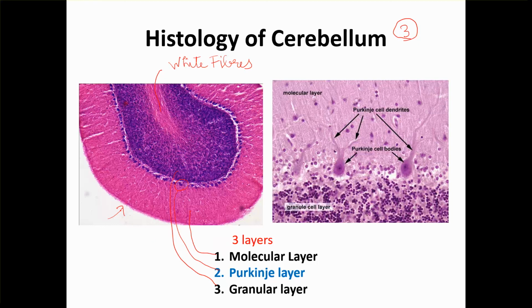Now where are the cerebellar nuclei? Obviously they are situated within, deep inside. So it is traveling through the axons of the Purkinje cells. This is the function of the Purkinje cells: it carries the afferents which reach the cerebellar cortex to the cerebellar nuclei via the axons of Purkinje cells.